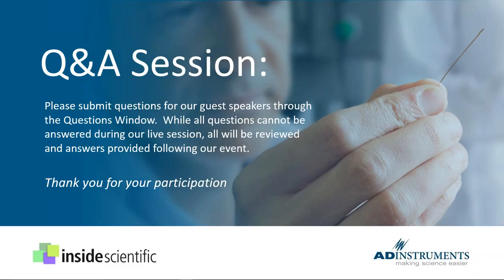The stroke volume has two aspects to it. One is at steady state, using whatever reference measure you need, and one is during a preload occlusion. Theoretically, those values at steady state and during the preload occlusion should be the same. The conductance signal is inherently nonlinear, but if there is a linear range, and you're within that range, then you're fine applying the steady state. If you're outside that range, which you will now see by your IVC occlusion, then you may want to apply a different correction factor based on that regression that you've done beat by beat. But that's really the key difference: you're able to identify during the IVC occlusion the range where your conductance catheter is linear, and you can apply a spot measurement.